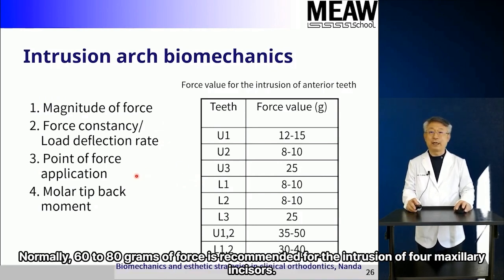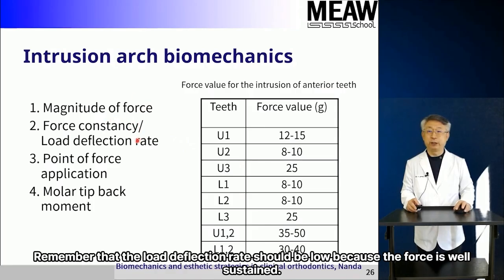Normally, 60 to 80 grams of force is recommended for the intrusion of 4 maxillary incisors. Remember that the load deflection rate should be low because the force is well sustained.